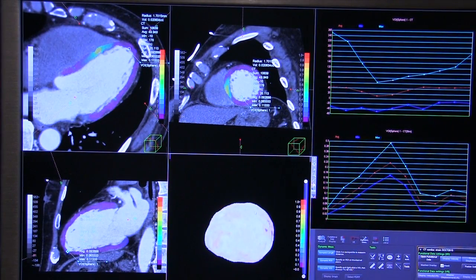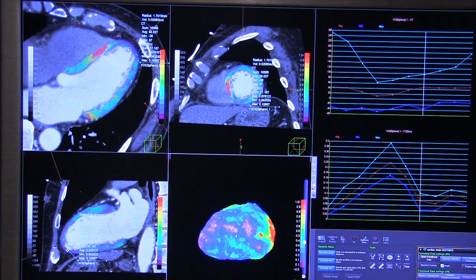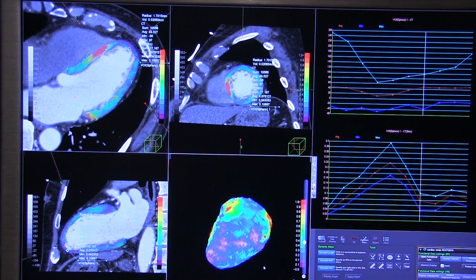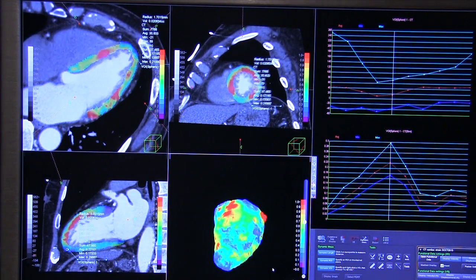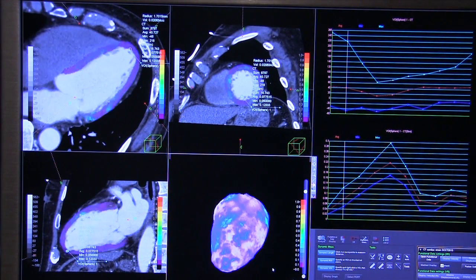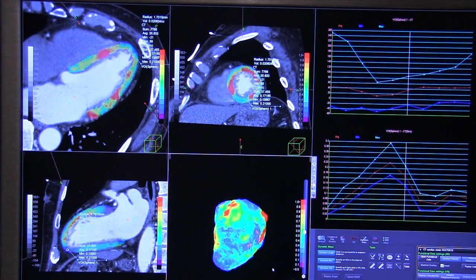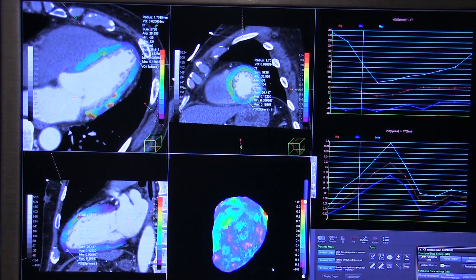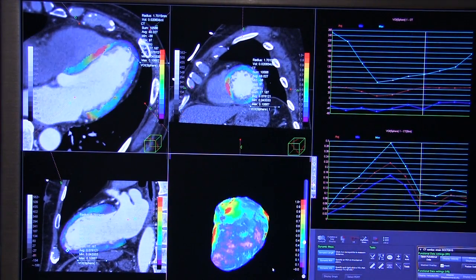Software vendors that are developing advanced visualization applications for CT are coming up with new ways to process that data to pull new information out. This is an example from Ziosoft showing a newly launched product for strain. This is showing a strain on a dynamic CT image, which may be used for either diagnosis of disease states in the future, or it could be used for analytics of the left ventricle for any defects.